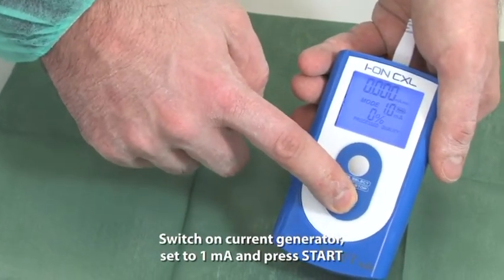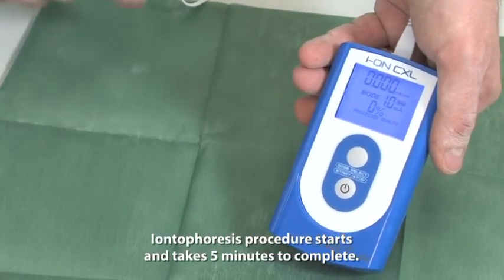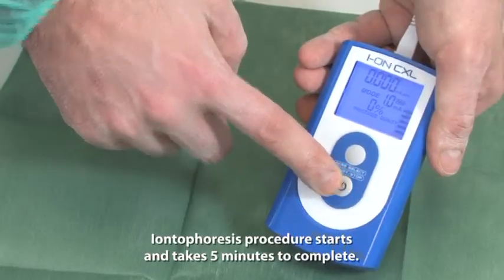Switch on the current generator, set to 1 mA, and press start. The Iontophoresis procedure starts and takes 5 minutes to complete.